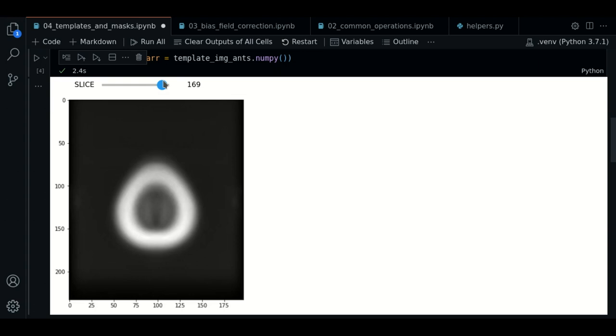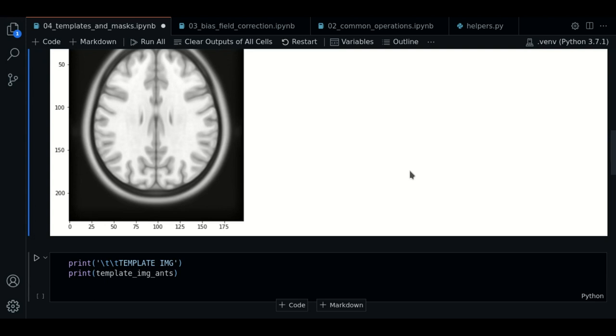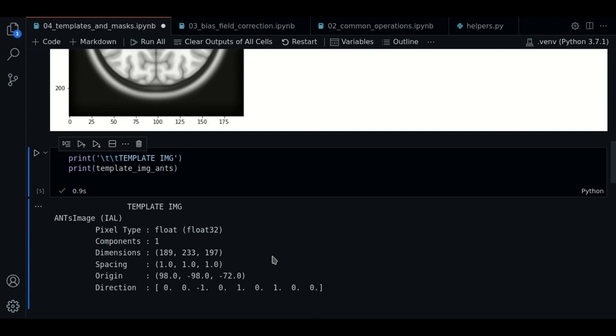So now let's print the basic information to see what is inside. As you can see, it looks pretty much like any other image that we have loaded before with ANTSPY.